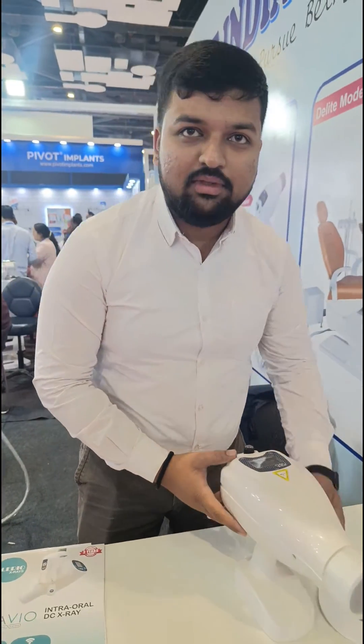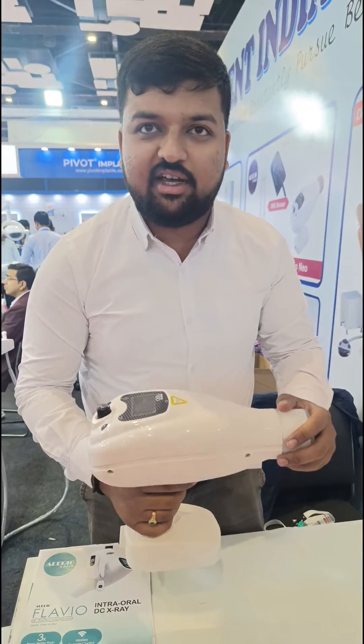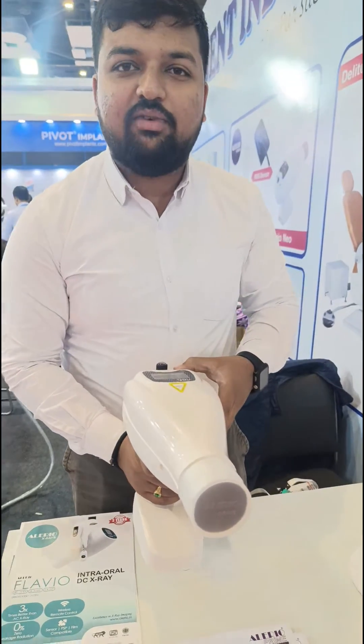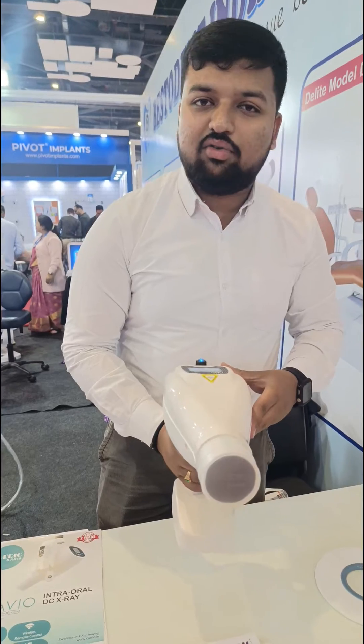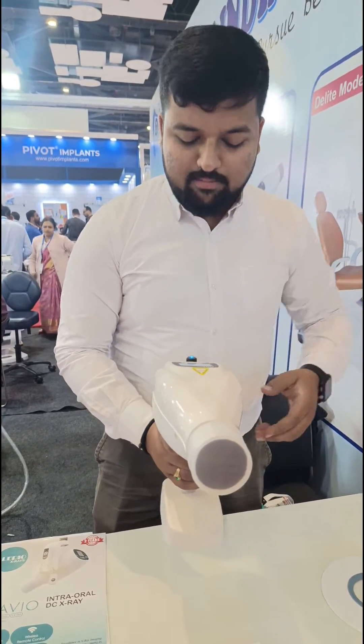Today I am going to show you how our portable X-ray Neo works. This is our 100 portable X-ray Neo — the world's safest X-ray. It comes with a 2.4 kg weight and a 3000 mAh battery. Once charged, you can take around 200 to 250 X-rays. The charging time is just 3.5 hours.